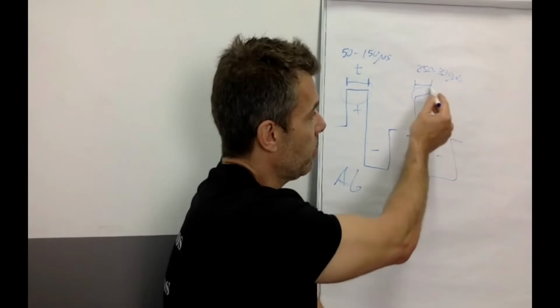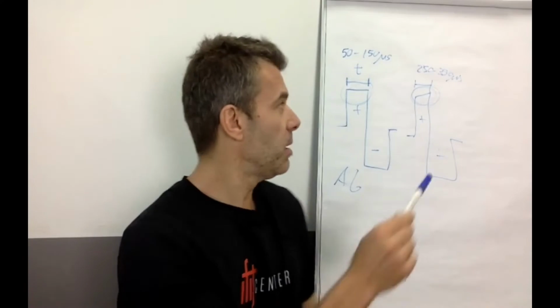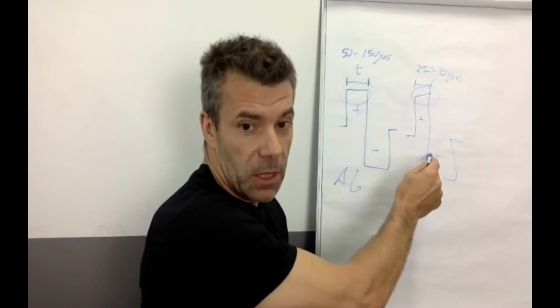But whenever you stimulate this one, you'll also be stimulating the other. Yes, is that clear? So whenever you're causing a muscle contraction, you're also stimulating this type of fiber. So from a proprioceptive standpoint, there's no problem at all. But whenever you stimulate this one, you don't necessarily have to stimulate the other. Unless you make a mistake, and I'll show you that now.